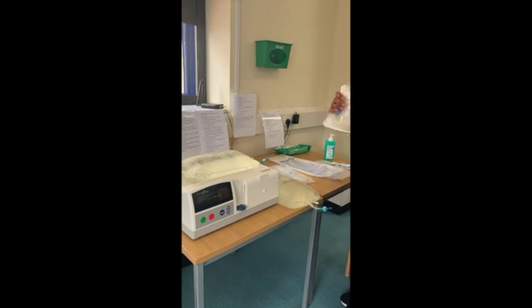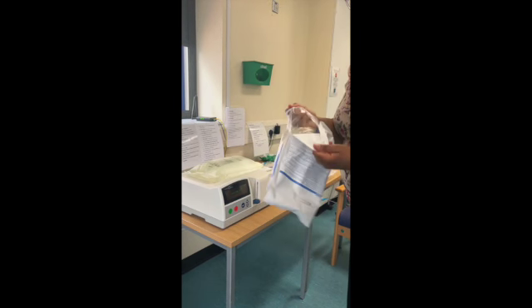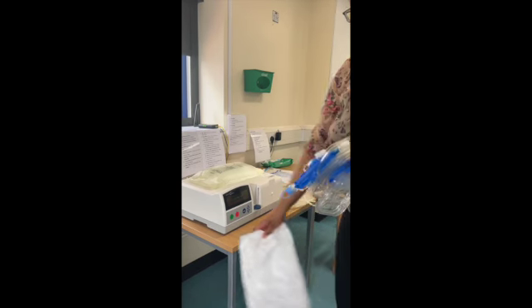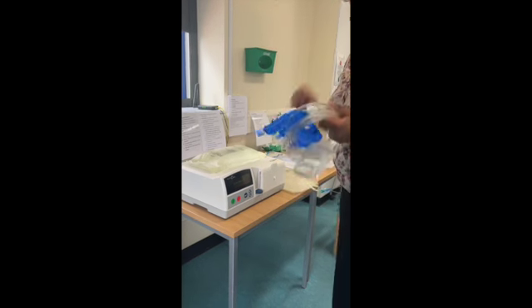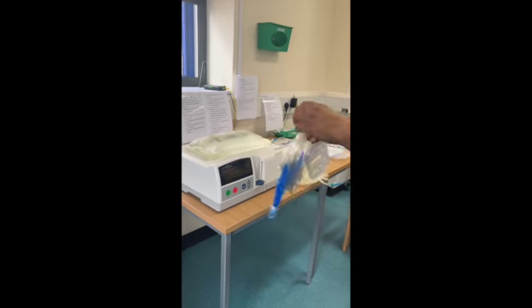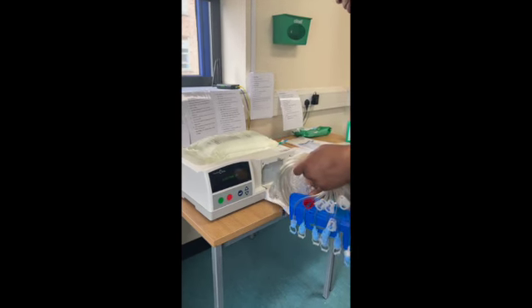So the first thing I'm going to do is load the cassette. So making sure I've got the right end to open it, opening up the cassette. Again, rubbish just goes on the floor so I don't contaminate anything. And I hold it like a handbag, so I'm leaving this label on to make it easier to hold them. So I'm opening up the machine to load the cassette in.